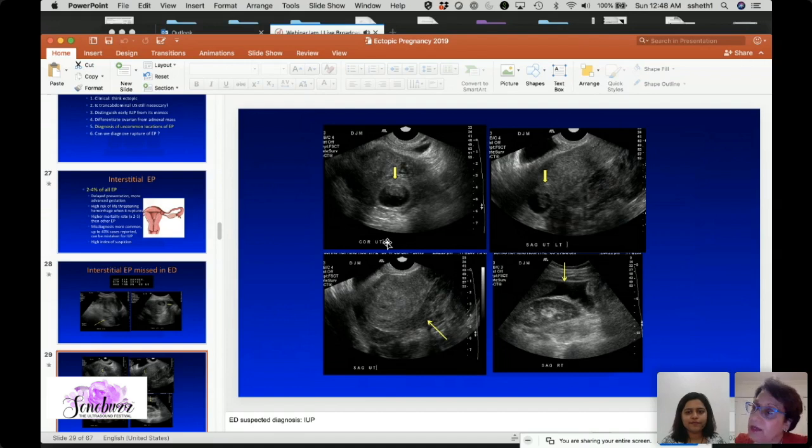Well, then you have to at least consider the possibility of bilateral ovarian tumors. Occasionally I've seen them, though they will not just look multilocular.